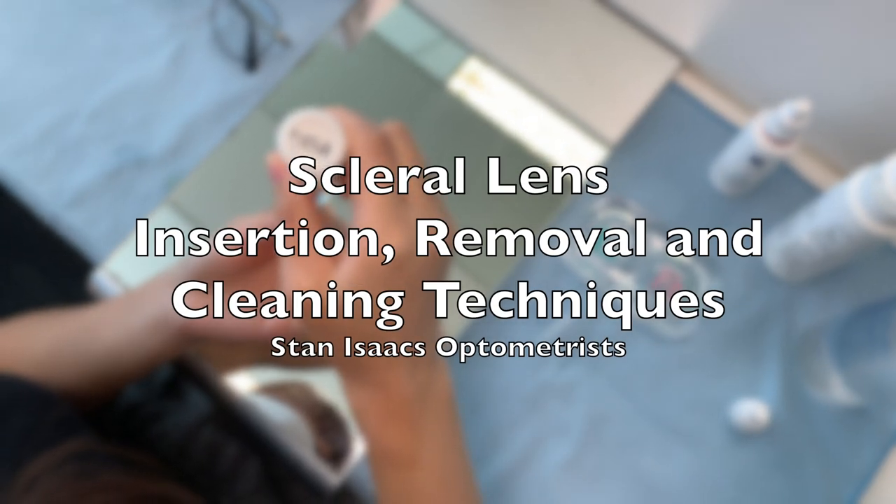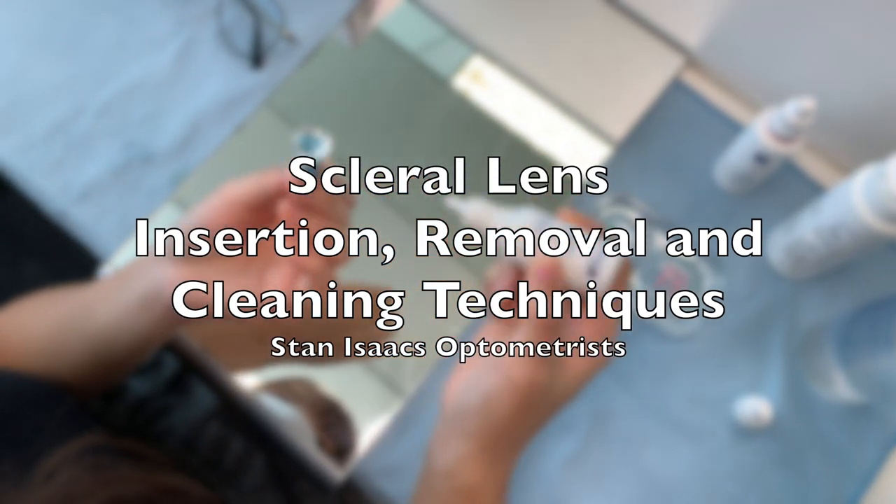Welcome to this video. I will be showing you how to insert, remove and clean scleral lenses.